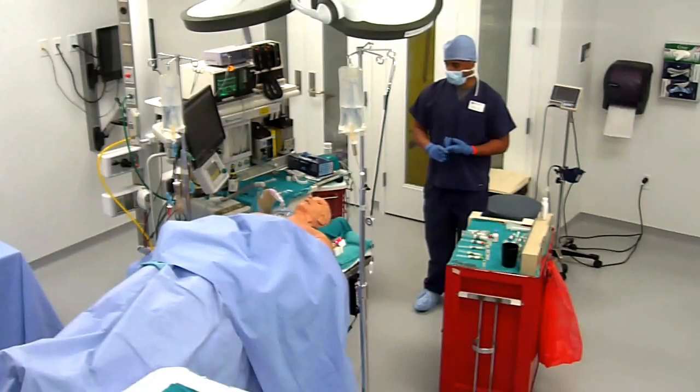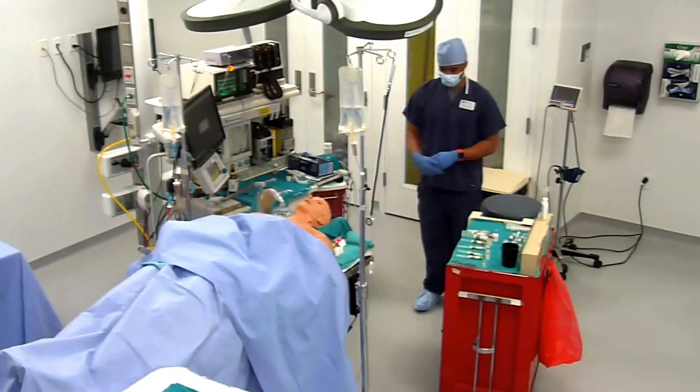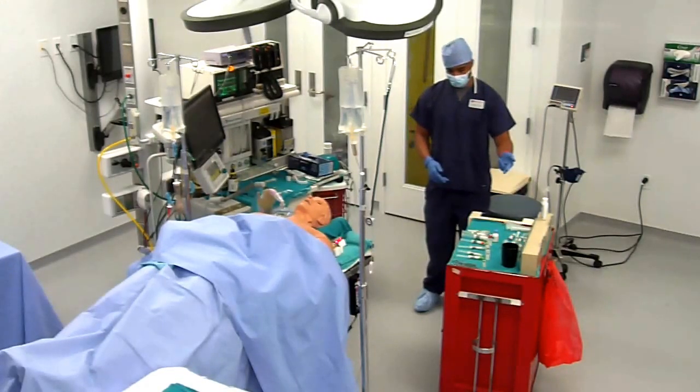Patient, a recent H&P has been performed. I've already performed my machine checklist with my suction at the bedside. My airway equipment is laid out on the anesthesia machine. My induction drugs and emergence drugs are laid out on the cart, as well as my emergency medications already drawn up.